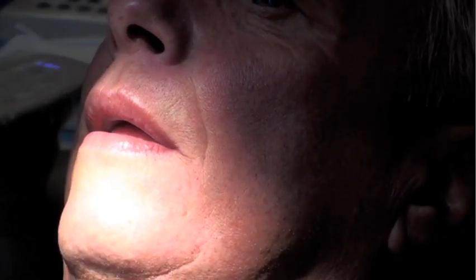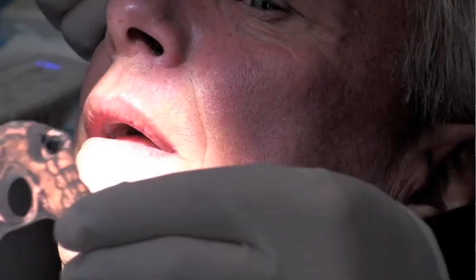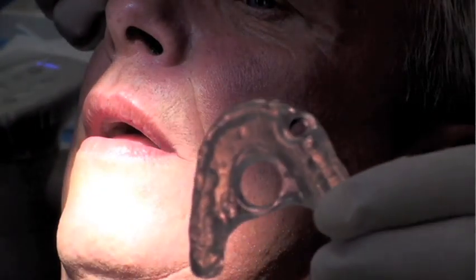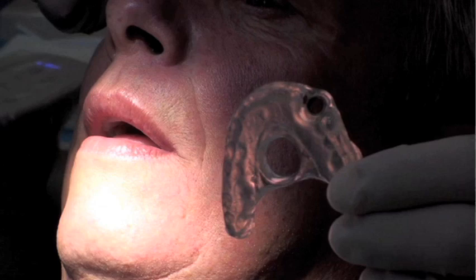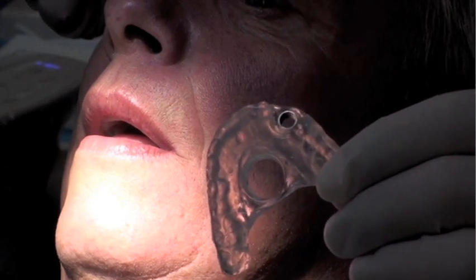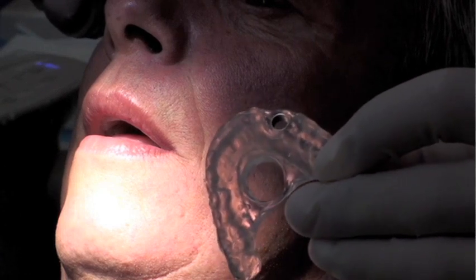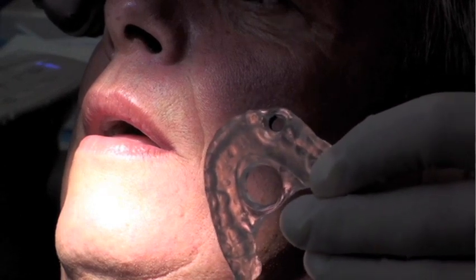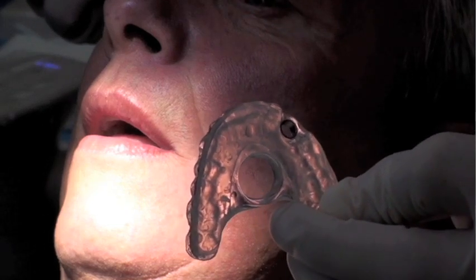This is our patient Larry, and this is appointment number two. The CEREC integration allows us to go from appointment one directly into surgery on appointment two. This plan was exported into the implant program and we were actually able to generate this surgical guide without any impressions, without any models.